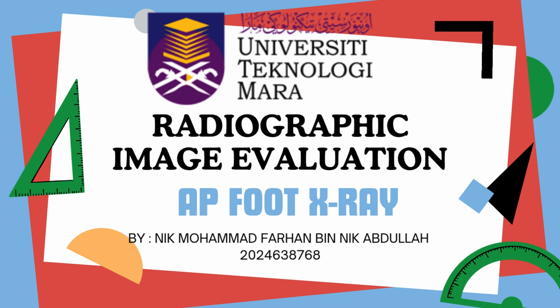Today I would like to share about my topic, which is radiographic image evaluation for AP foot X-ray. I will go into details for each part, and I hope all of you will enjoy my video and get more understanding about this topic.